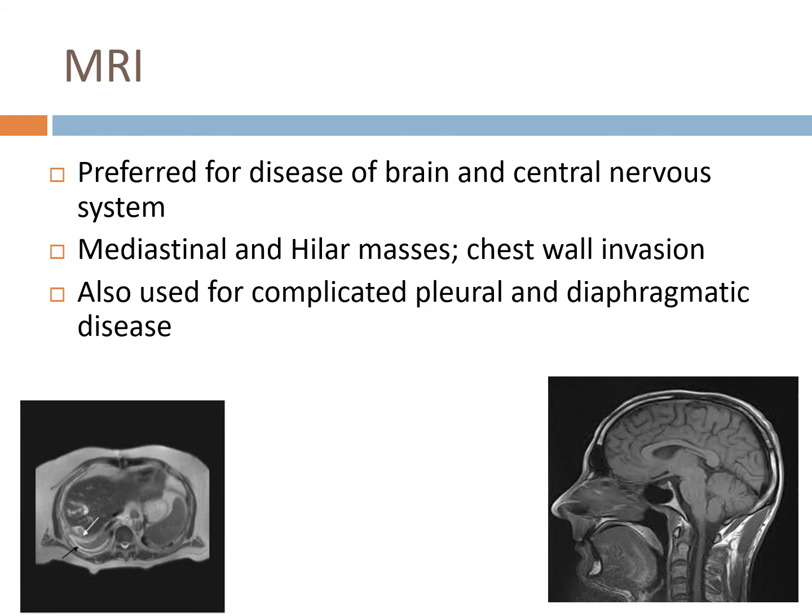Like I said, I think you're going to see it used a fair amount. You can generate really thin section images of any part of the body, including the heart, the veins, the arteries, from any angle and direction. And unlike the CT scan, the MRI is a headache to get them all set up and get them in there, and it takes a while. Once they get in there, they're usually in there for a good 30 to 45 minutes, sometimes longer.